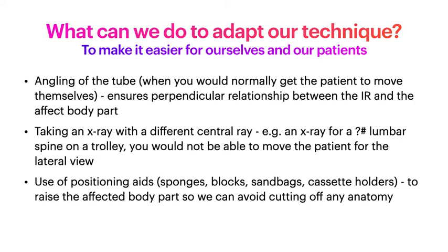And also adaptive techniques include using positioning aids, so things like sponges, blocks, leg holders, sandbags, cassette holders, all of these things so that we can help get our area of interest on the image first of all, but also to help the patient help us as much as they can to support them and their affected body part.